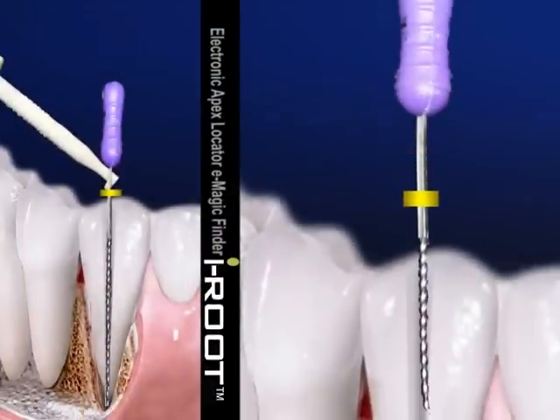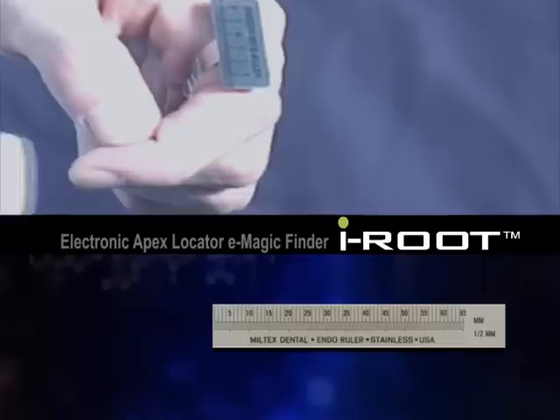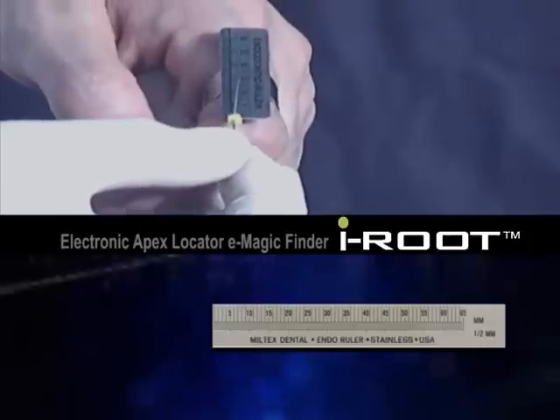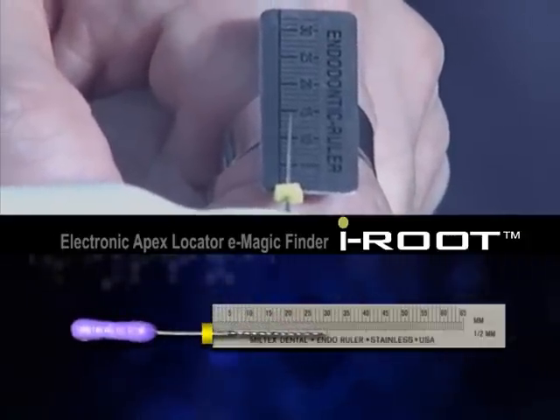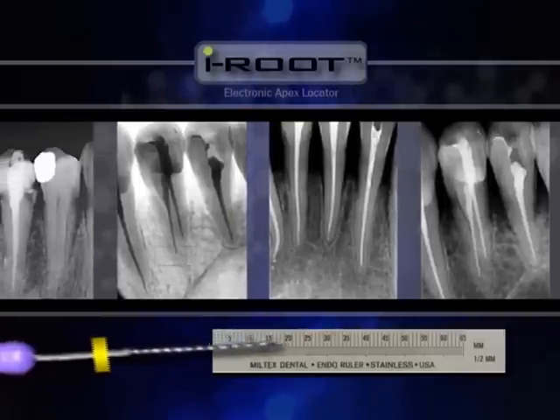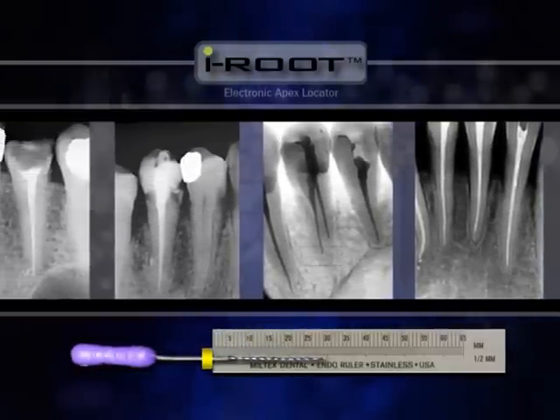Move the rubber marker as close as possible to the root canal's entrance and slowly take out the file. Use a dental scale as needed to measure the length from the rubber marker to the file's tip. This is called working length. It is highly recommended that you take an x-ray to check the measurement.